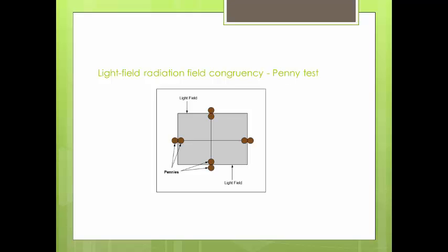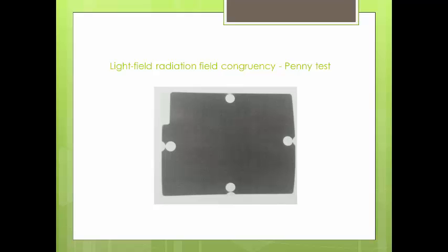Here is an example of what your penny test should look like. You can see that we have an 8x10 light field shown by the blue rectangle on the screen. In the center of each side there is a penny within the light field and a penny outside of the light field, and those pennies are touching. Once processed, you can see all of the inside light field pennies as well as a little bit of the outside pennies.